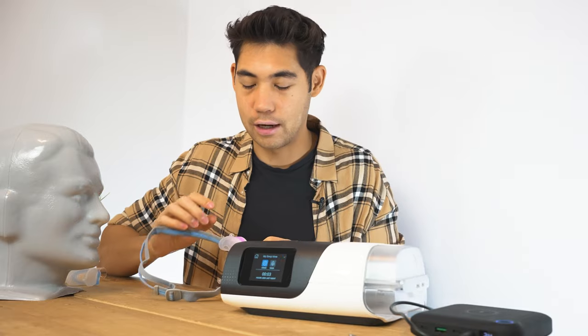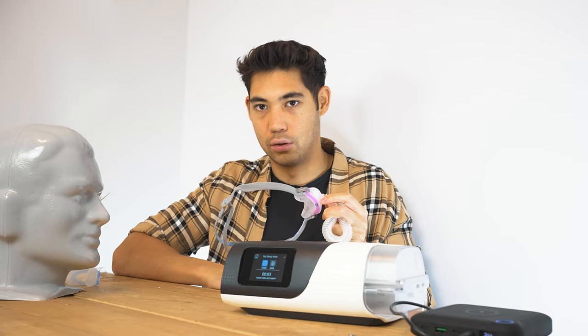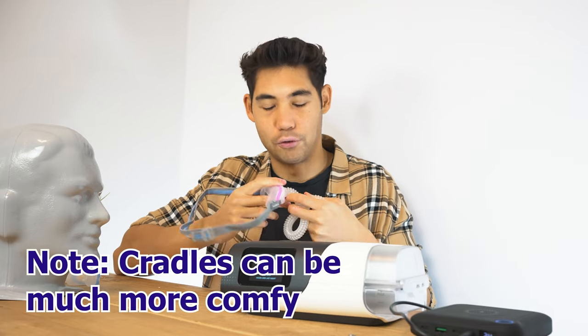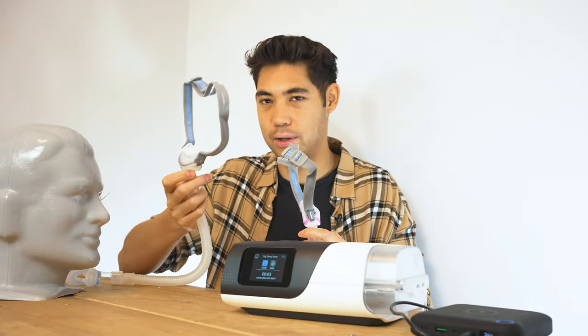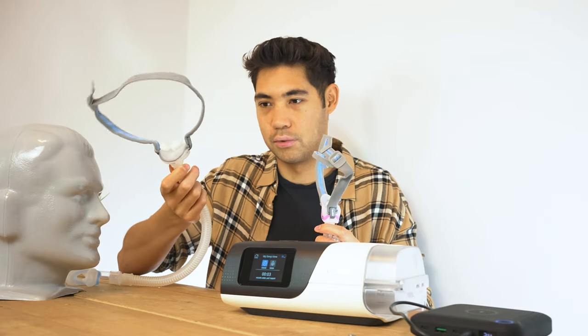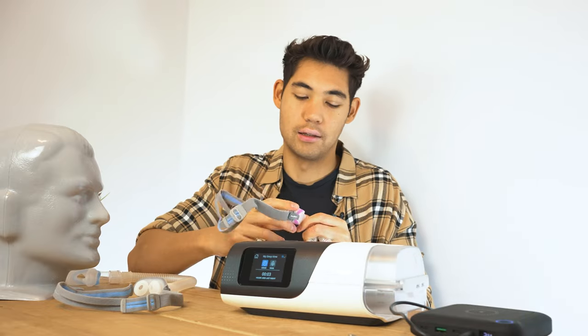That being said, I do find that out of all cradle masks, the N30 is one of the best ones. It leaks extremely minimally for me. When I say it's not as good as the P10 in terms of leakage, that's because the P10 for me just rarely leaks at all. So this one has just a little bit more leaking.